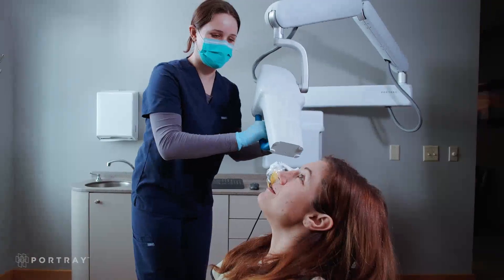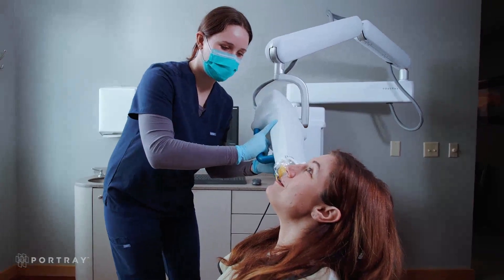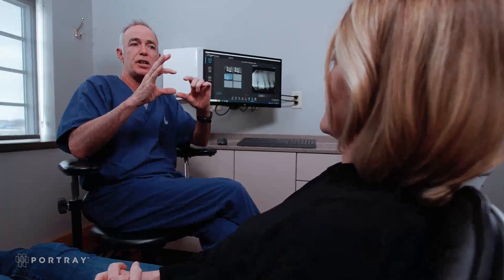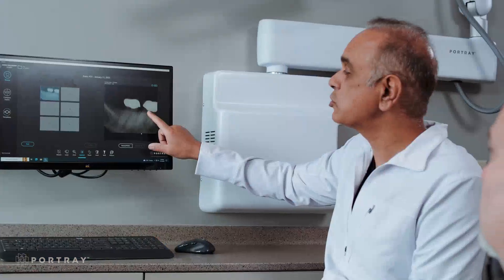The tools allow me to get the best view in any case that I'm treating. There are still going to be cases where a cone beam is going to be the best technology to see down the long axis of the tooth, but that's a limited number of cases.